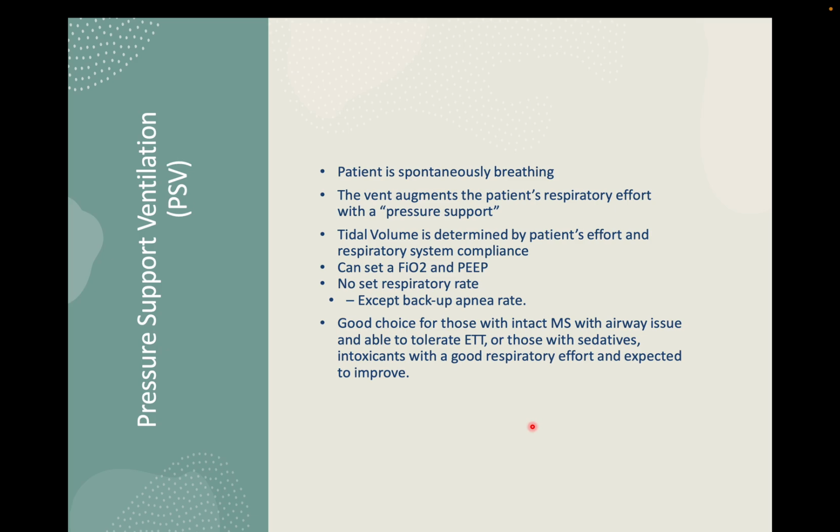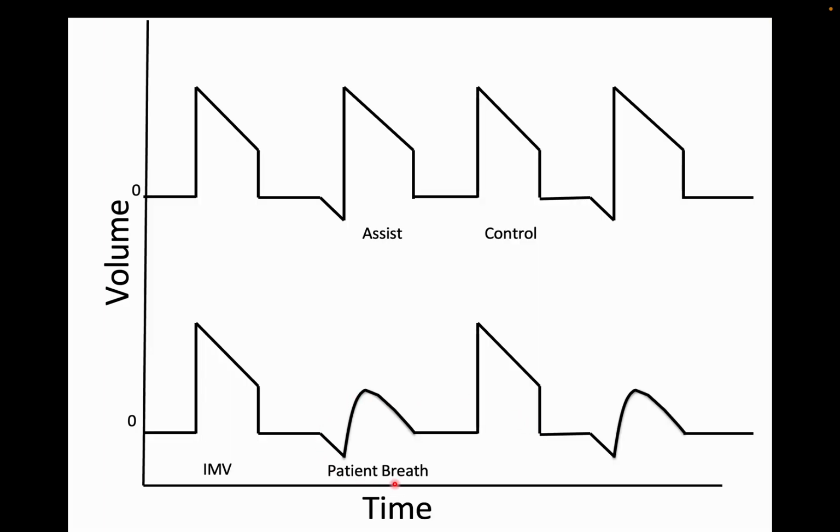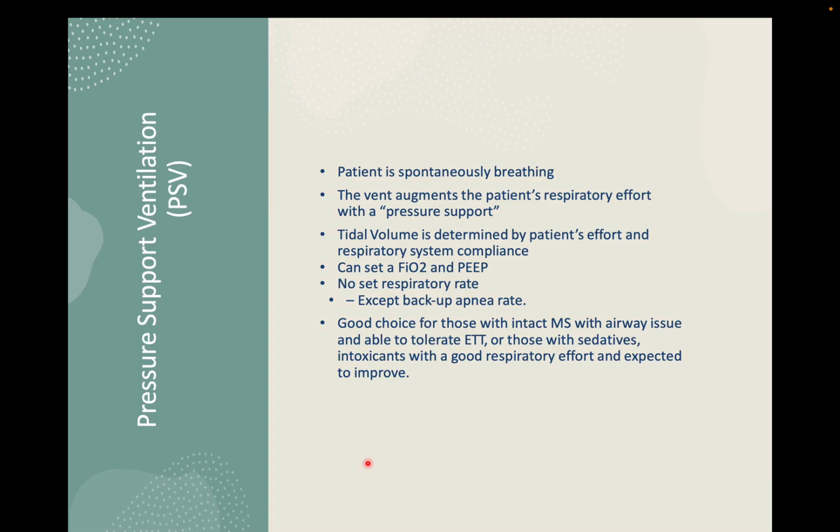Slowly, if the patient is able to take spontaneous breaths and his respiratory capacity is good, because if the respiratory capacity is not good, the breath generated won't be good enough to ventilate the lungs properly. So only when the patient is conscious enough, able to generate enough respiratory capacity, and there is no muscle fatigue, and he is able to generate enough pressure for the breath, then you convert to SIMV, and slowly change to pressure support ventilation, that is CPAP, then wean off. But you need to put them on SIMV so that the patient's muscles won't go into fatigue.